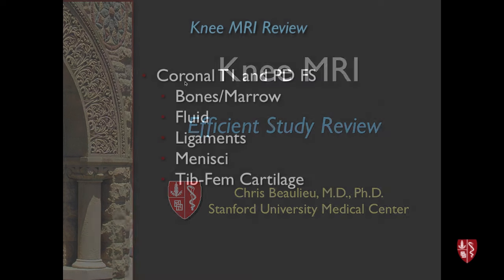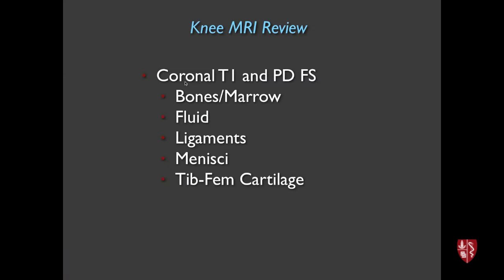When I look at the knee, I go through the coronal images first with an inside-out approach: bones and bone marrow contours, look for fluid or effusion, then ligaments from medial to lateral, then the menisci. Be aware you can see meniscal tears on just one plane — there's a tendency to rely only on sagittal for menisci, but coronal is quite good, and axial can be helpful too. Then I go through the tibiofemoral cartilage in the medial and lateral compartments.